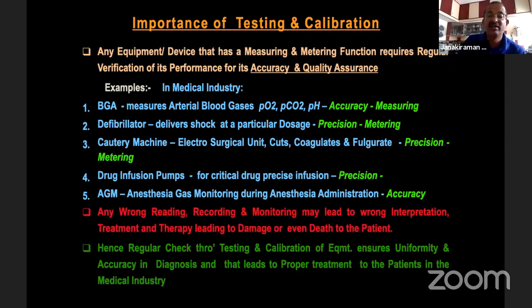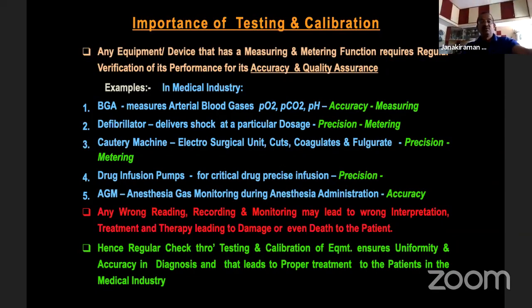So any wrong recording, wrong reading, wrong monitoring may lead to a wrong interpretation. The wrong interpretation leads to wrong treatment. That will lead to the wrong therapy, and that may lead to damage to the patient, increased hospital stay, and sometimes death to the patient. So hence regular checks through testing and calibration of the equipment will ensure uniformity and accuracy in diagnosis that leads to quality treatment to the patient.